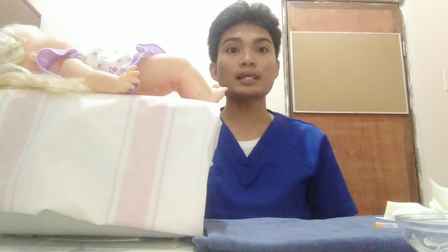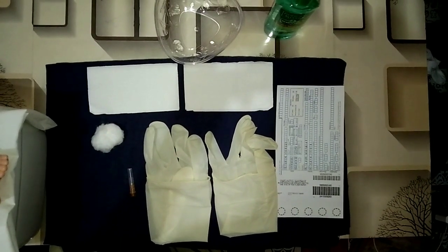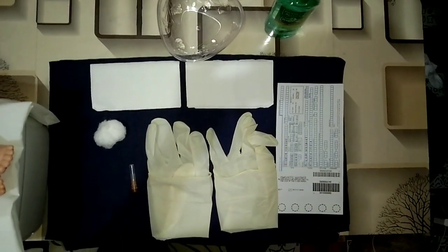Now, after we introduce ourselves and verify the client's identity, we will now be preparing the equipment. The equipment that we will be using for the procedure are the following.